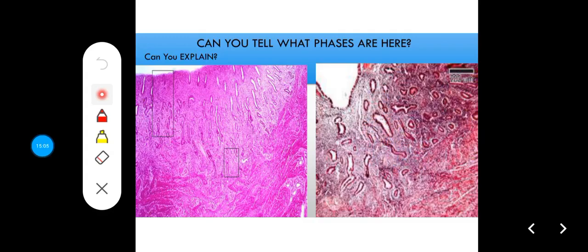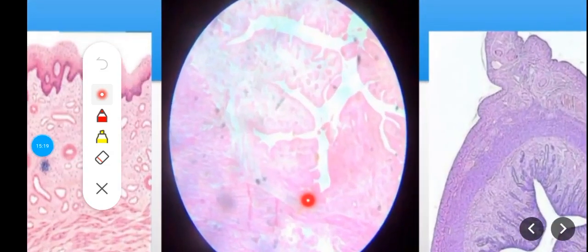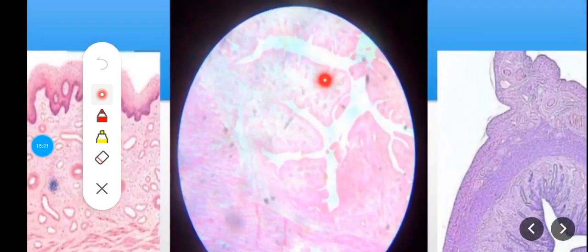So this as well, the uterus, the muscle layer, and then the serosa or the adventitia, the muscle layer, the endometrium. If you zoom in, you will appreciate the uterine glands as they extend deep into the basal layer of the mucosa.